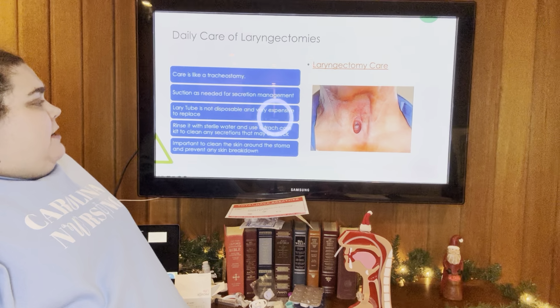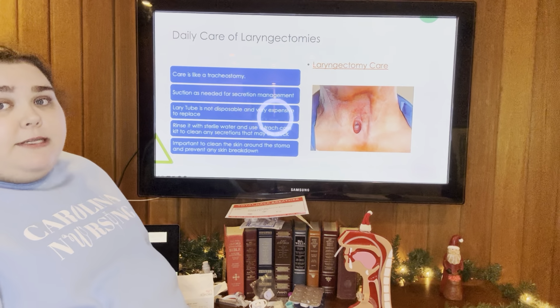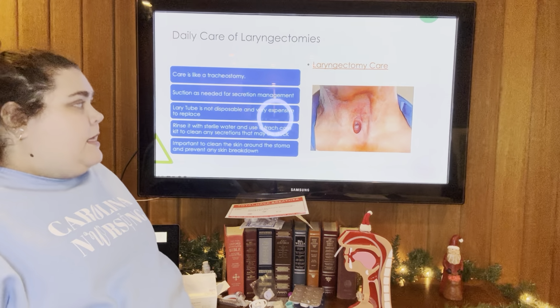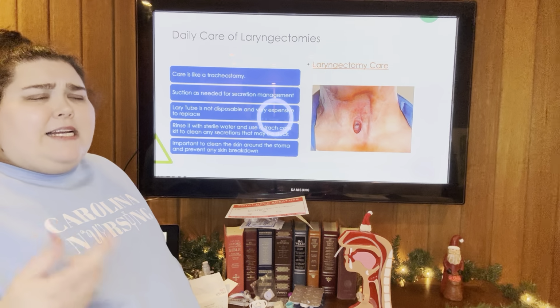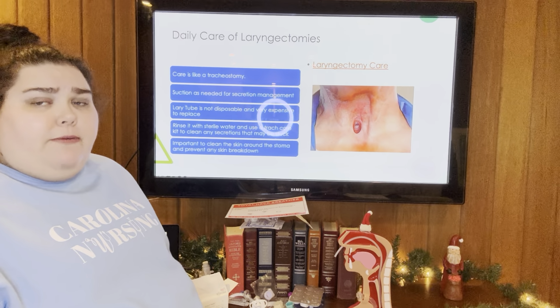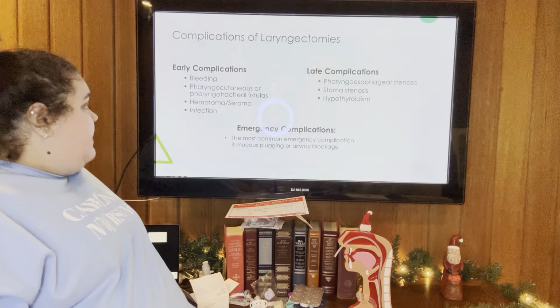And we want to be very careful to clean the skin around the stoma, like we said, because as we talked about with the trachs and with the Lary tubes, the skin is very prone to break down, and we really want to try hard to avoid that.